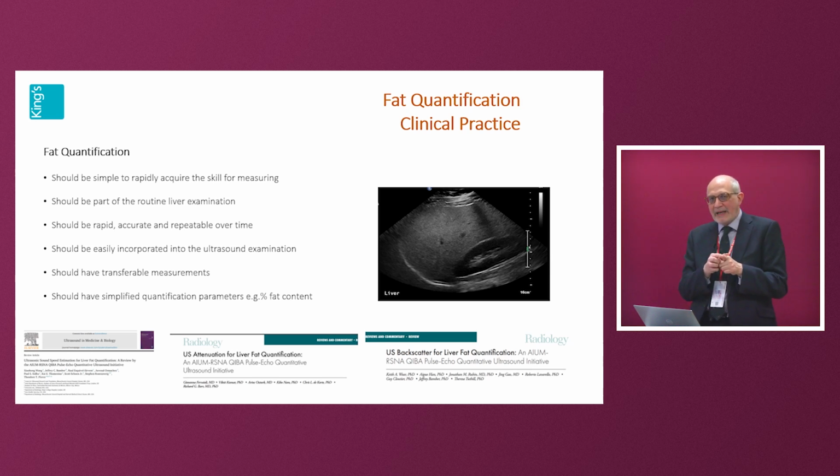And vendors are coming out with a one button that does the whole quantification package for you. And that same button can do your elastography for you as well. So this is all coming, and it's workflow that improves. And it should become, therefore, part of your routine examination. Like you're measuring the length of a kidney or you're measuring the portal vein velocity, this should take less time than that. And this is probably more useful than the portal vein velocity that you measure.